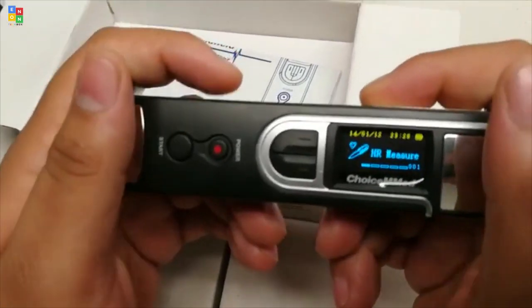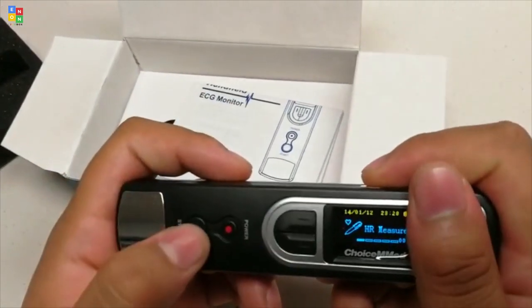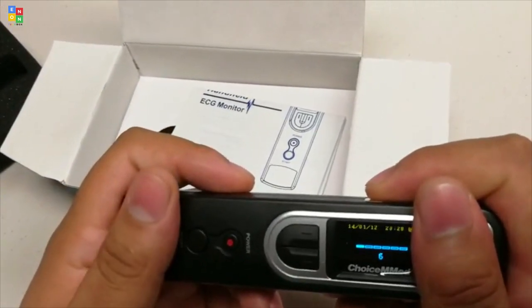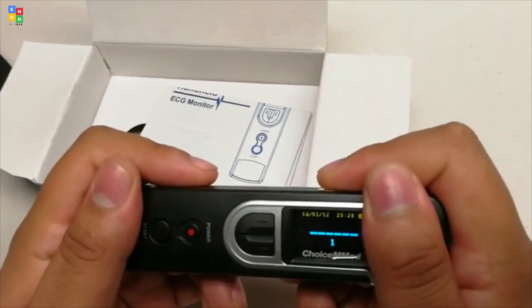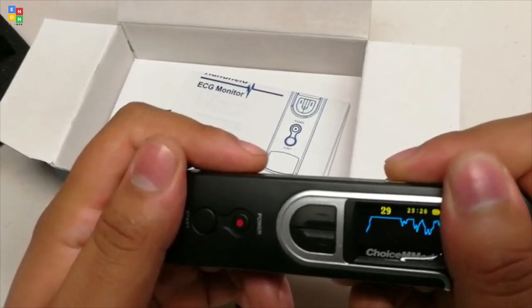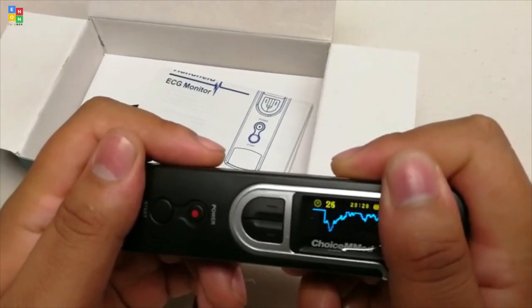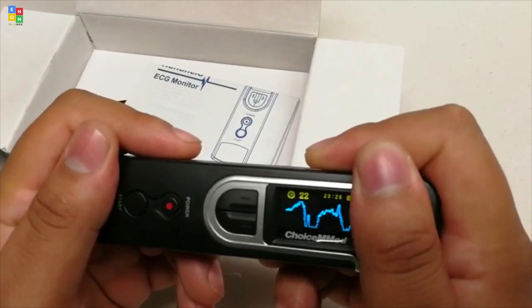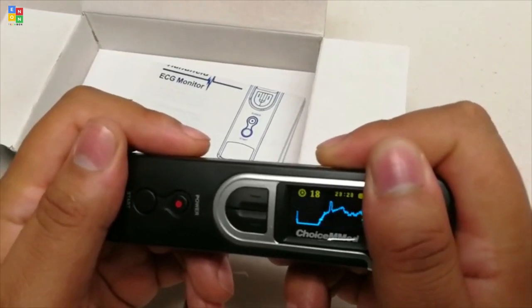Please place your hands as so to cover the leads, and you can press the start button, giving you about 6 seconds to make sure your hands are positioned in the correct areas before beginning a 30-second ECG waveform reading. This reading can detect early beats, missed beats, and stable waveforms.